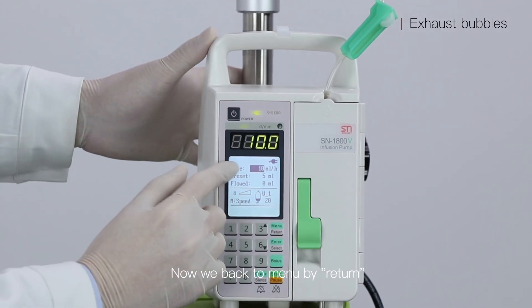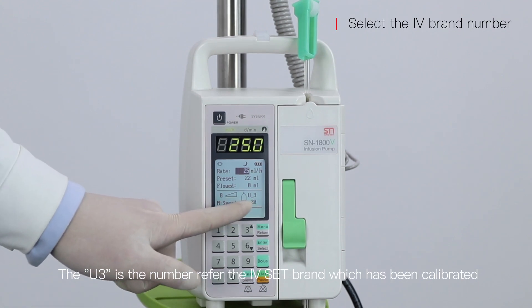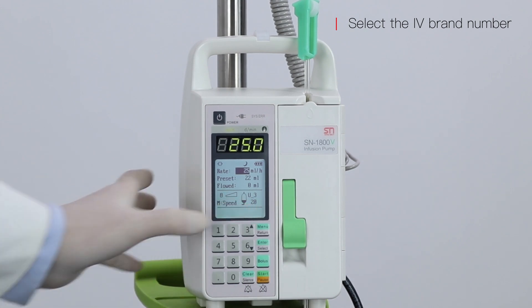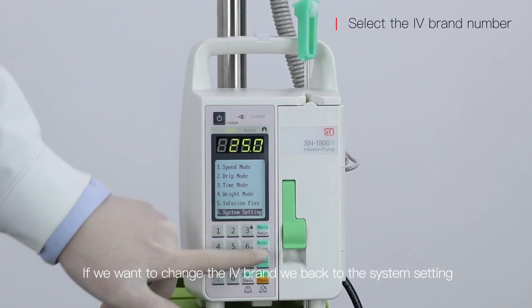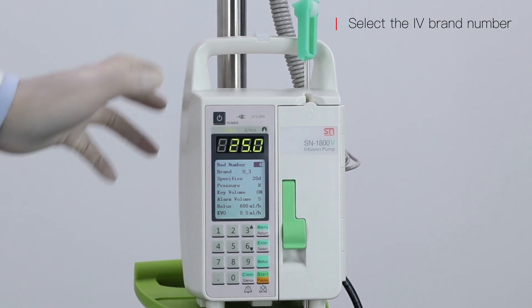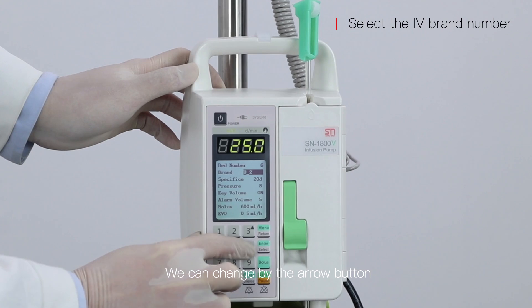Now we go back to manual mode by pressing return. The U3 is the number referring to the IV set brand which has been calibrated. If we want to change the IV brand, go back to the system setting and change it using the arrow button.